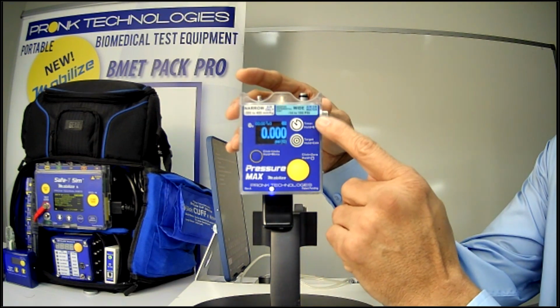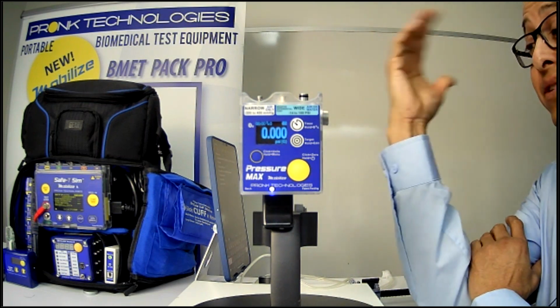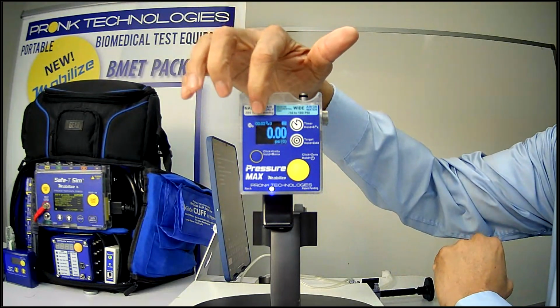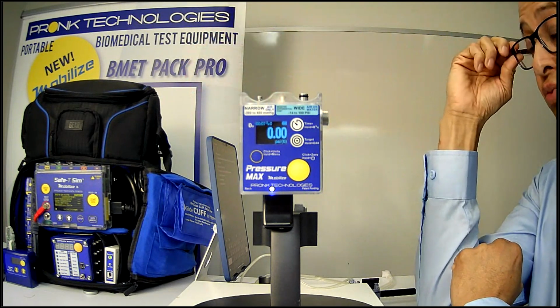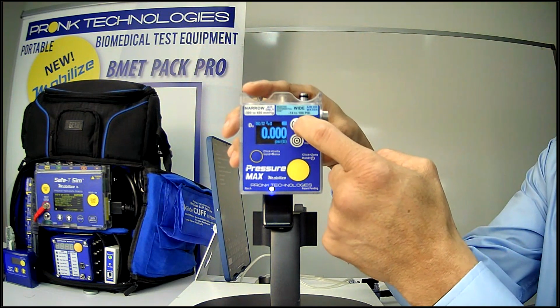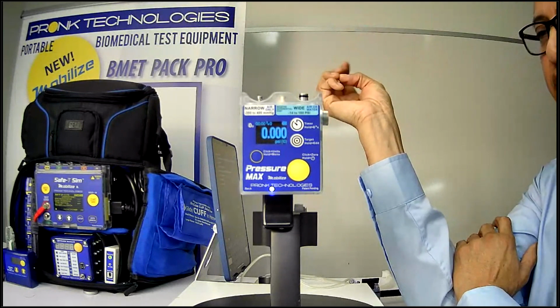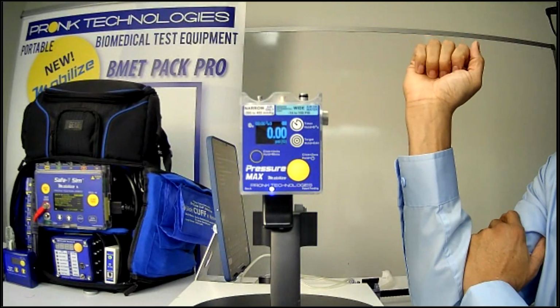You have a timer button. The unit is built with a digital timer, so you can utilize it if you need to do leakage tests where you need to do a time test. To do that, you can simply press this button here. The timer in the upper left will turn on and start capturing the elapsed time since we started the test. If you want to stop the timer, simply press the button here to stop it, and you can press it again to reset it back to zero. So it's a nice feature for doing leak tests or time tests where you want to know how long it took, or what the leak rate was at that particular pressure.